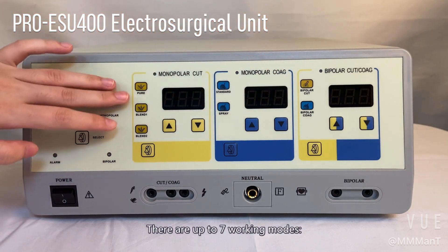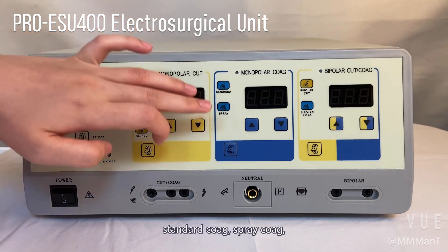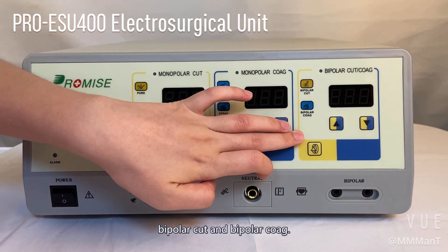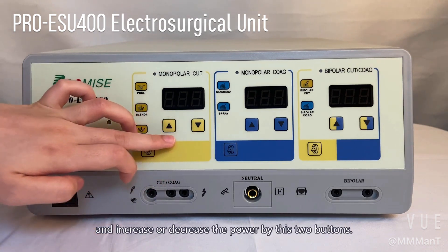There are up to seven working modes here: pure cut, blend one, blend two, standard coag, spray coag, bipolar cut, and bipolar coag. We can adjust the working mode by pushing this button and increase or decrease the power by these two buttons.